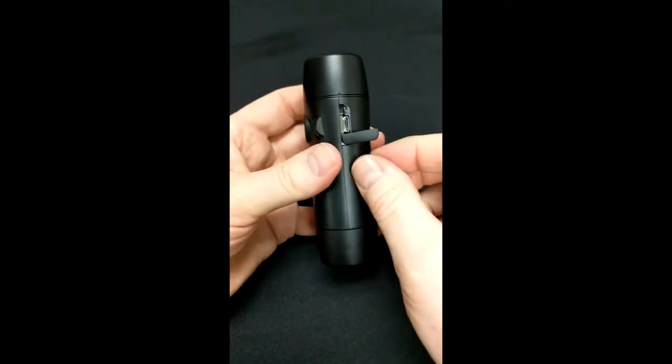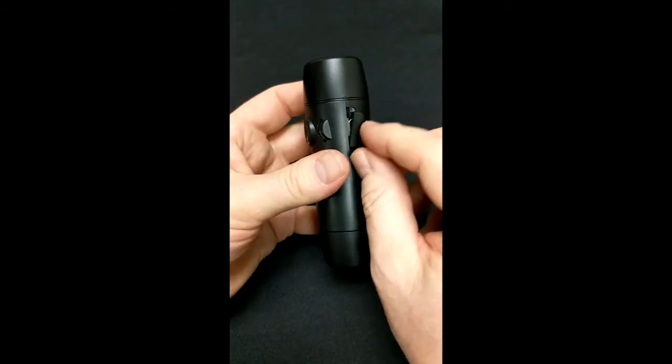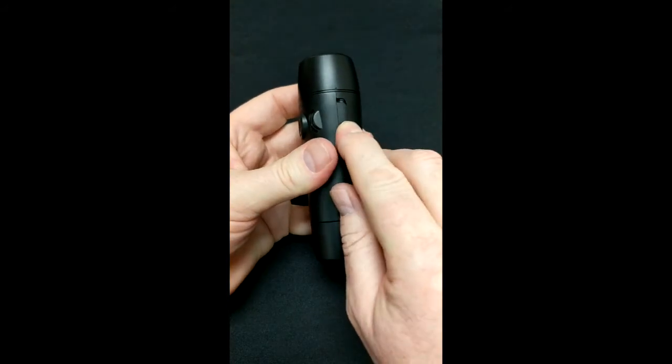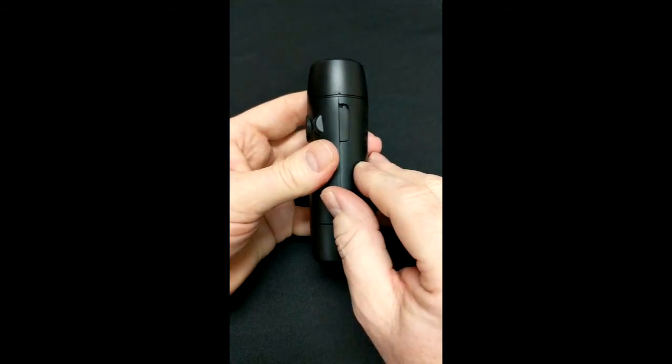Once you've completed the charging, simply rotate the dust cover back in and press it into place.